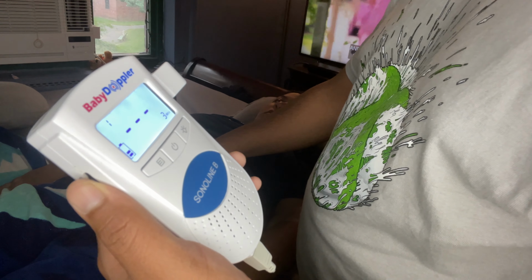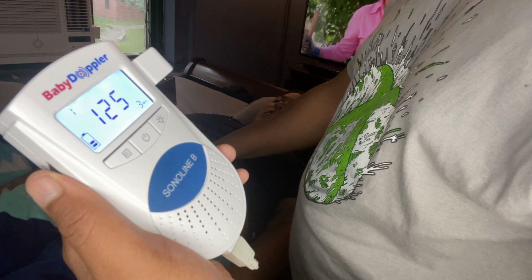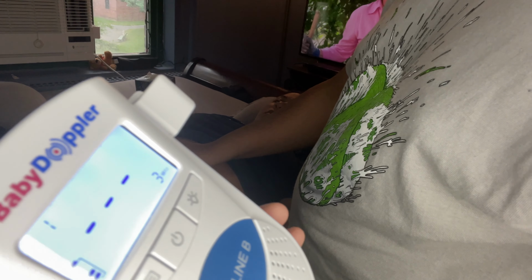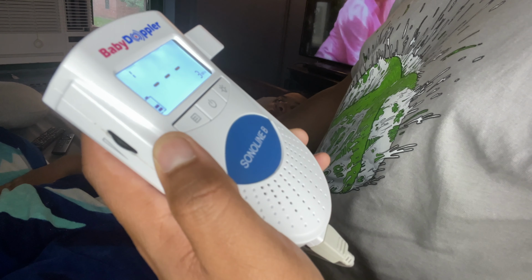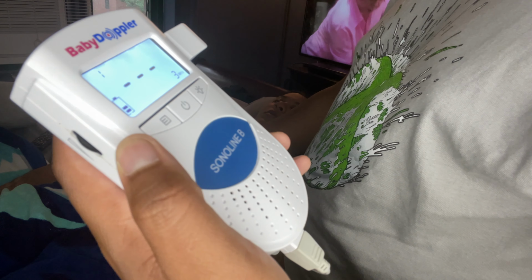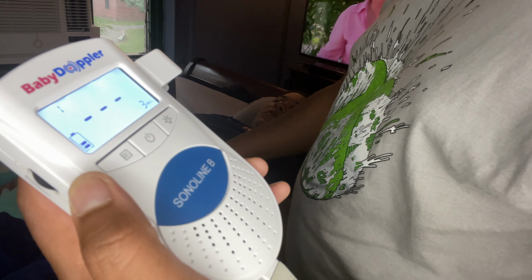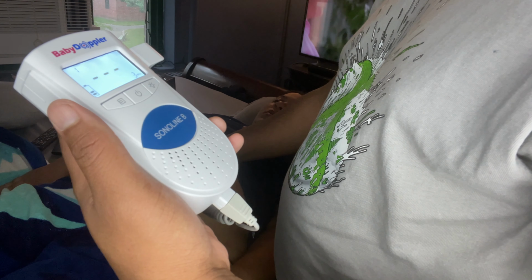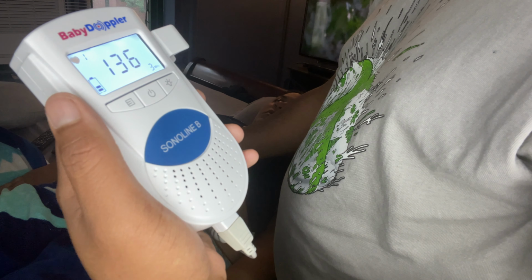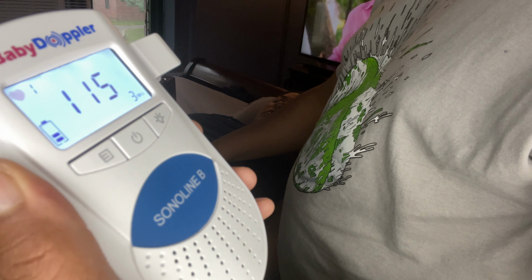This is my wife's heartbeat. See? Slower, more calm. See, that's my wife's heartbeat. Now let's try to find the baby's again. See now the galloping.